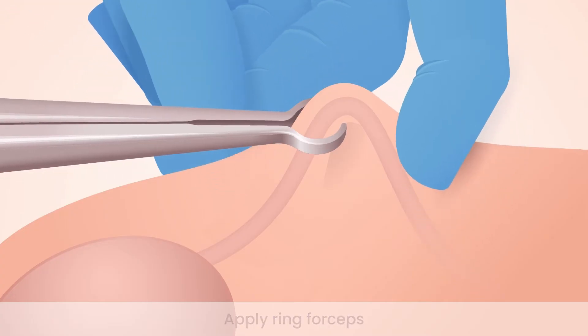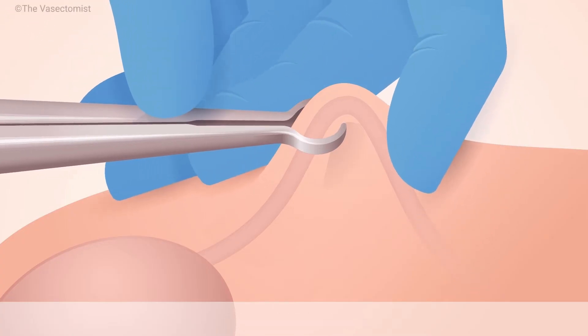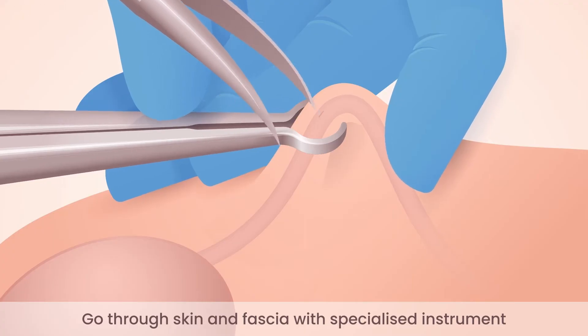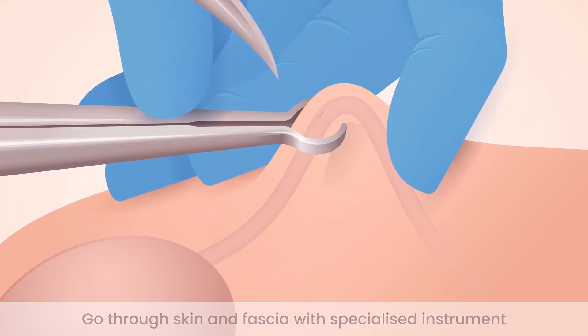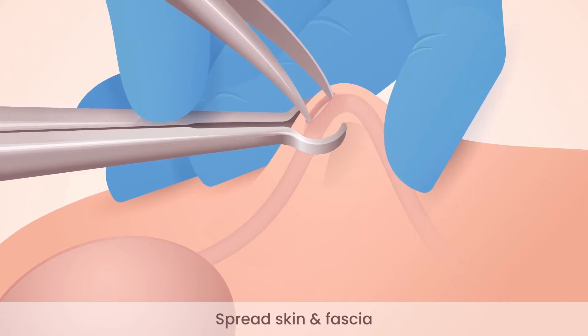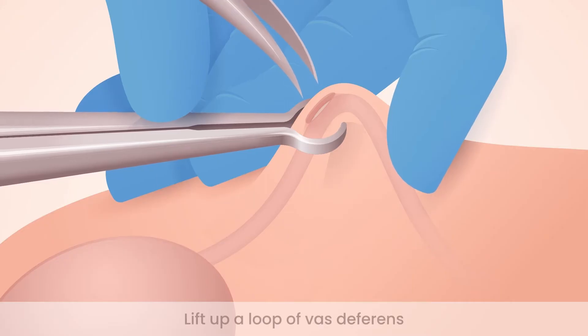Insert the tip of a specialized curved instrument through the skin and fascia just into the tube. Then go through the same hole but with both blades and spread the skin and fascia — a strong layer of tissue that encloses the tube like the skin of a sausage.